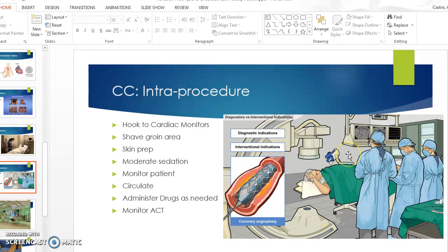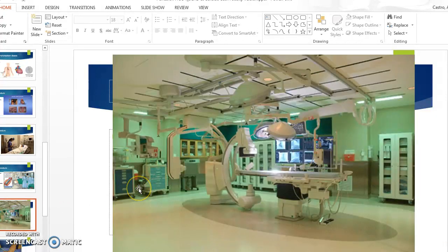So here is just a little infograph, and we have our patient, and this is probably the physician. They usually stand closest to the head, and then the scrub tech stands next to the physician. And this one has two scrub techs, so he's an important doctor there. I have down here in my notes, it's a beautiful cardiac catheterization laboratory. So the patient lies on the table here.